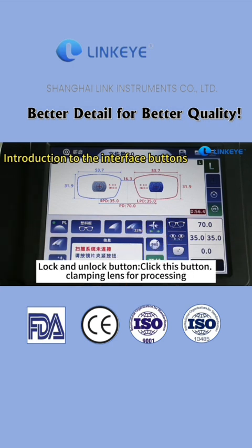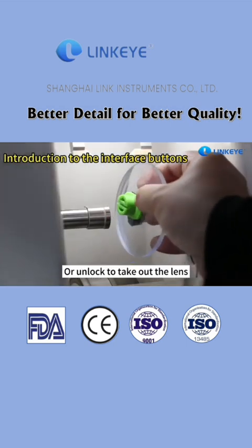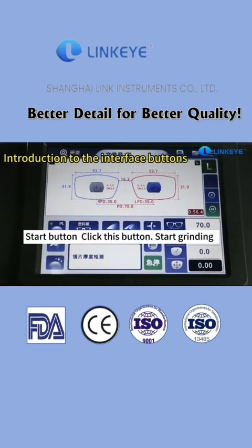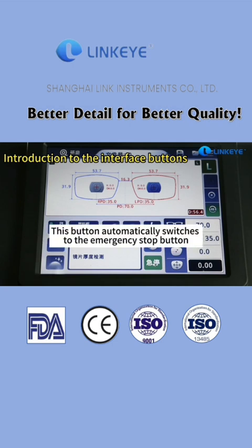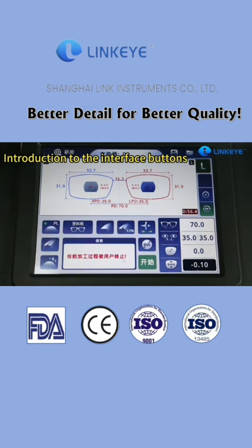Lock and unlock button. Click this button to clamp the lens for processing, or unlock to take out the lens. Start button. Click this button to start grinding. After grinding starts, this button automatically switches to the emergency stop button. Click the emergency stop button to stop grinding.